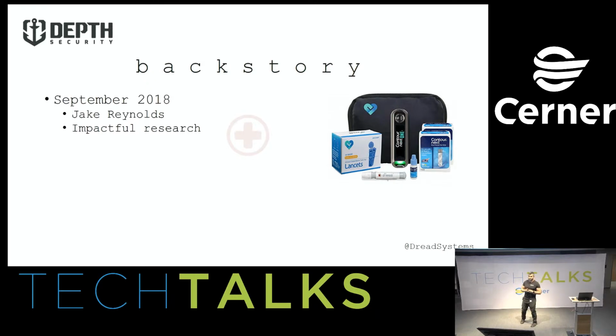So a little bit of backstory for this. Our CTO at Depth at the time that I was working there, Jake Reynolds, like I said, there was a slow week and we wanted to investigate something, have some impactful research. I just described how the device works, and basically there are two attack surfaces. You have the Bluetooth communications between the glucometer and the cell phone, and then you have the synchronizing from the cell phone or the mobile app to the cloud.